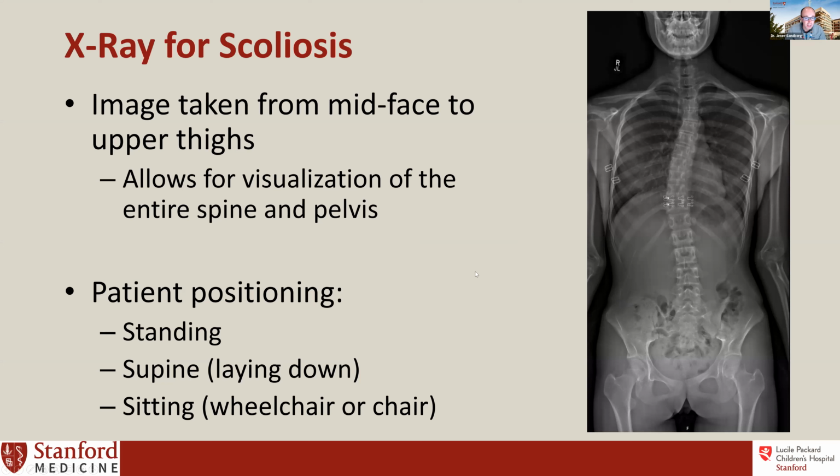And, again, I'm not going to get into too much of the pathology, but looking at the pelvis can help the orthopedic surgeons determine how the scoliosis affects the tilt, or how the pelvis lies within the entirety of the skeleton. And so in terms of patient positioning, this could either be done standing, supine, or, in other words, laying down, sitting, either in a wheelchair or a chair. And this all depends on your child's ability to cooperate either with standing, laying down, or sitting. And generally it's in the order form what type of positioning is desired.